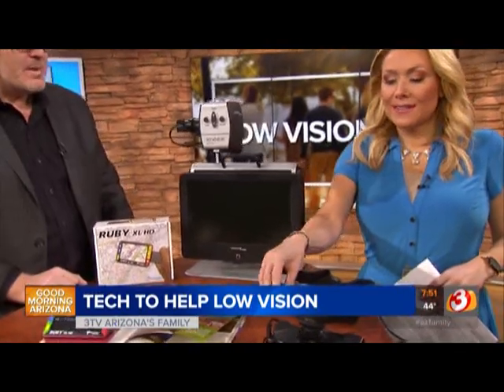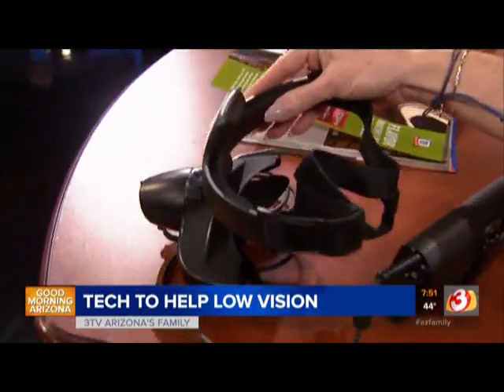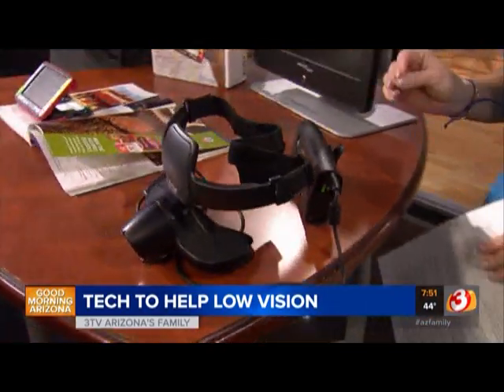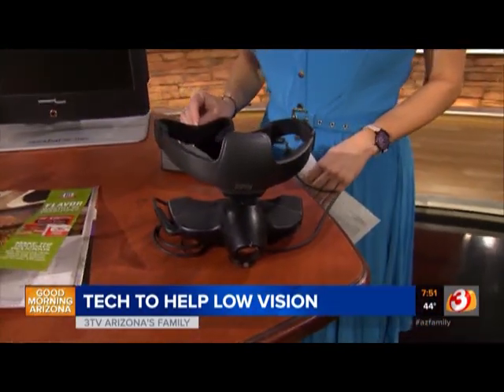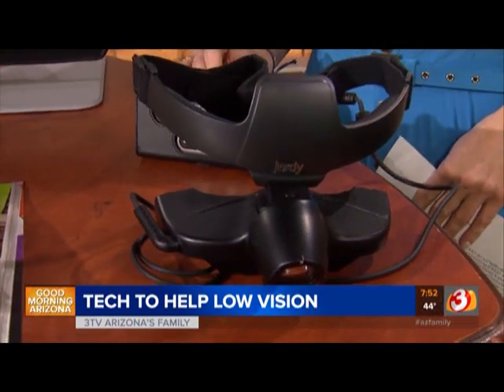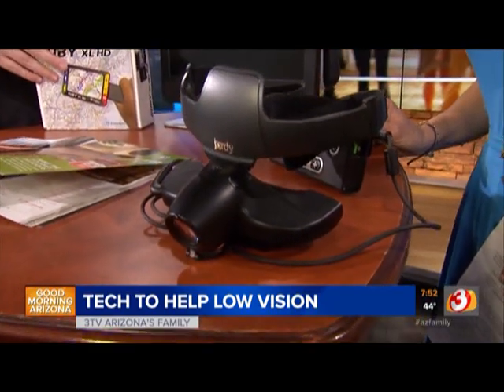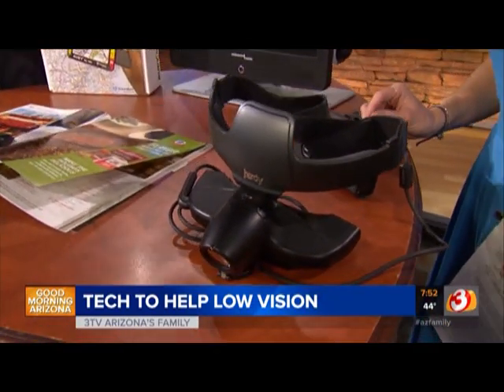Okay, now what on earth is this? Is this 3D virtual reality? What do we have here? Not quite. Augmented reality. So what this does is it takes the principles of magnification and contrast that we have in the other devices and puts it into a wearable device, so for hands-free, you might want to watch television, you might want to read a book, you might want to take it to a sporting event, things like that. So it brings the magnification up nice and close to the eyes.